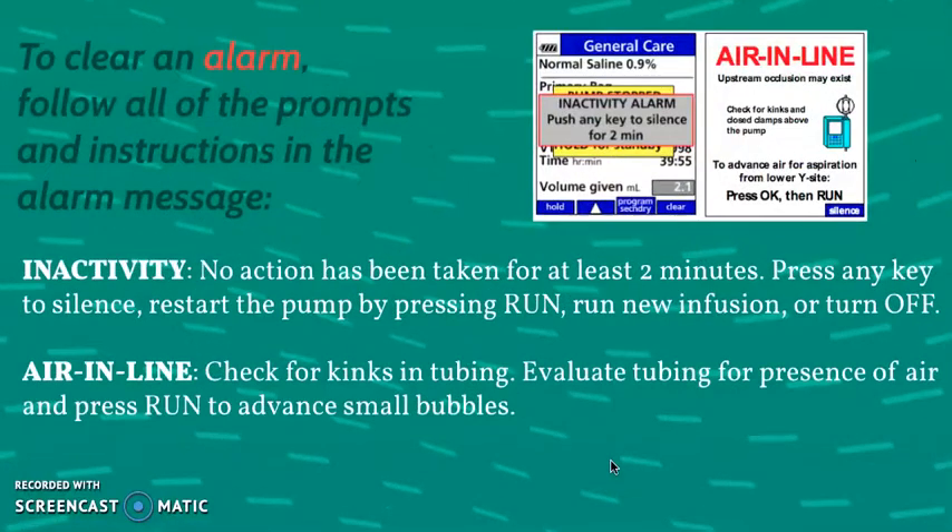Now we'll go into the alarms that come from the pump and require troubleshooting. The most common ones: one is inactivity, which means no action has been taken for at least two minutes — maybe you're still setting up the room, setting up your line, or talking to the patient. Simply press any key to silence the machine, or once you're ready, start the pump by pressing run, run a new infusion, or turn it off if you're not working with it.